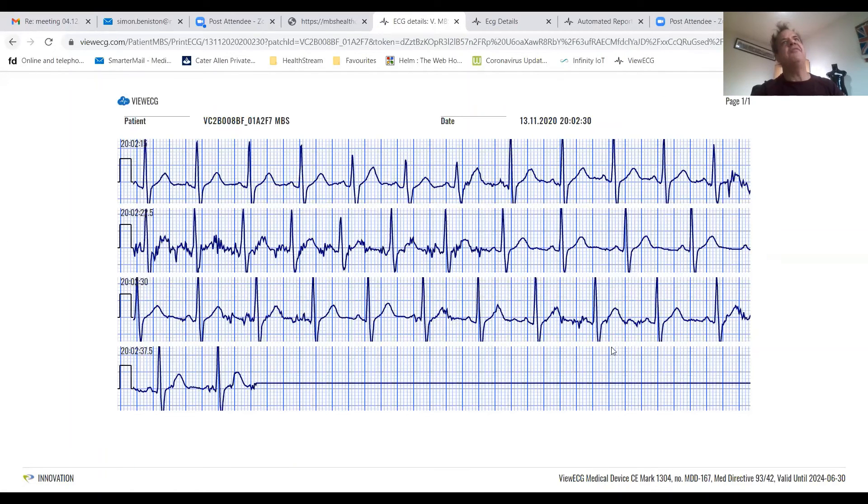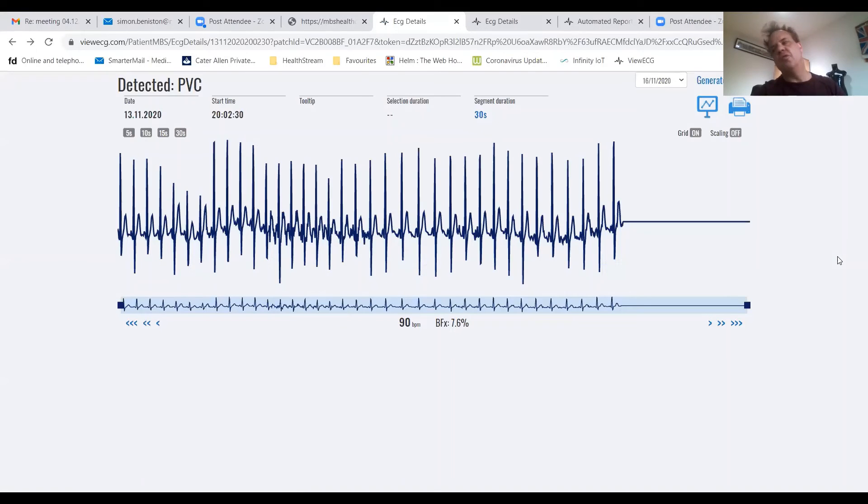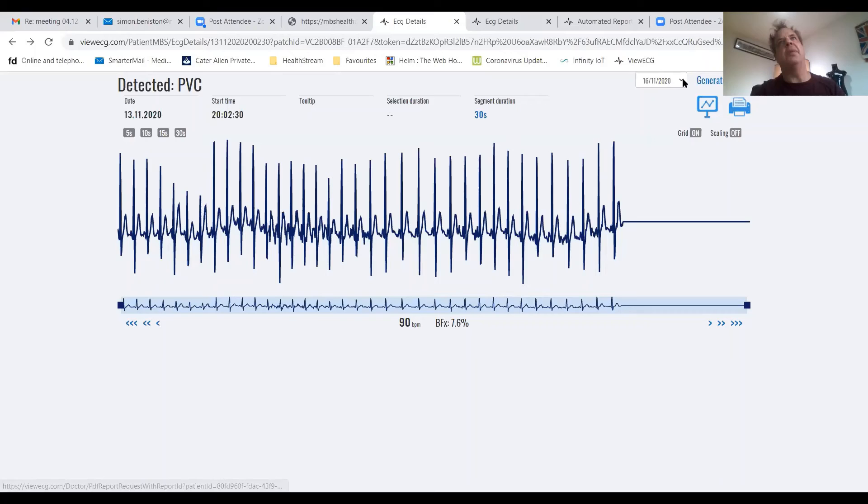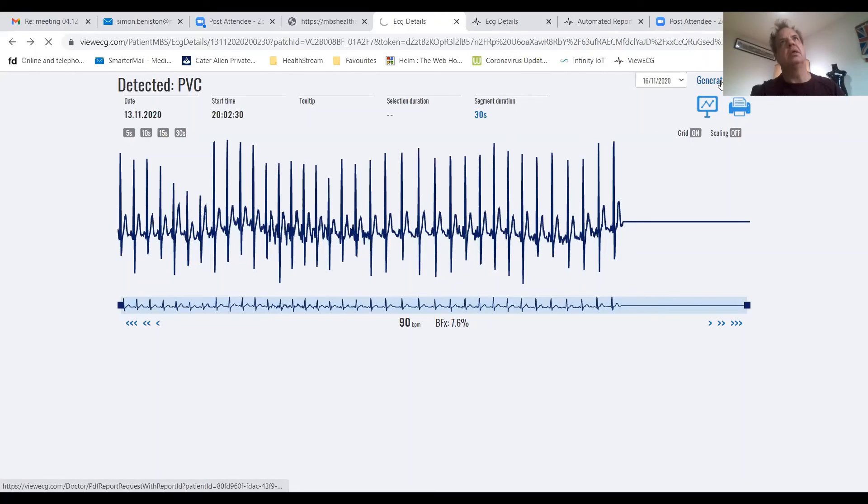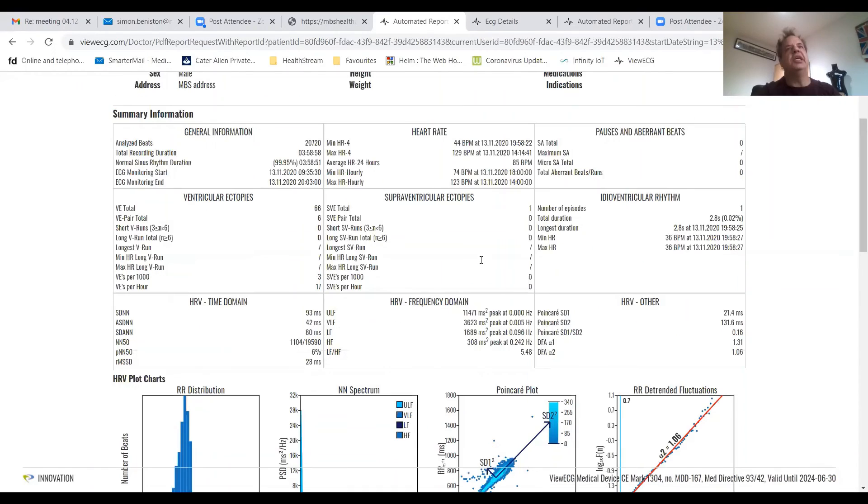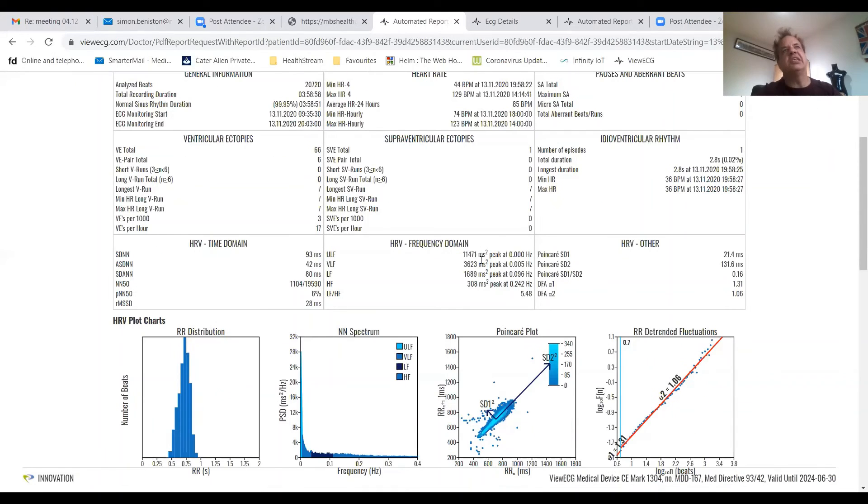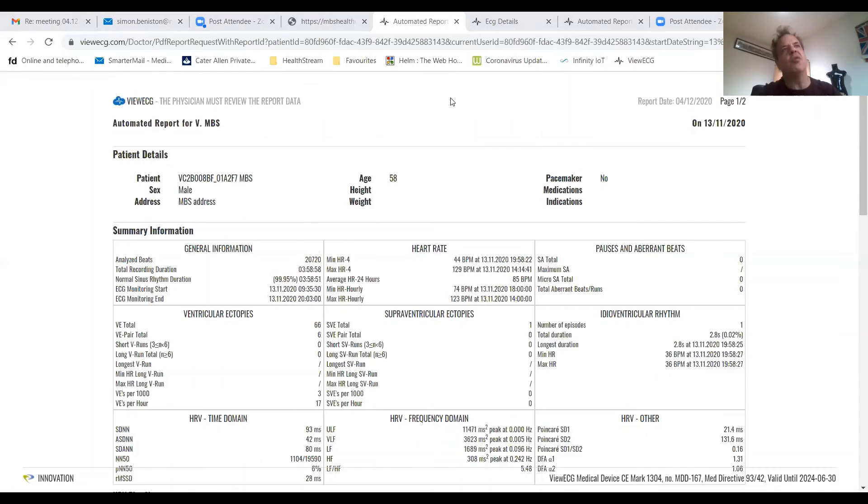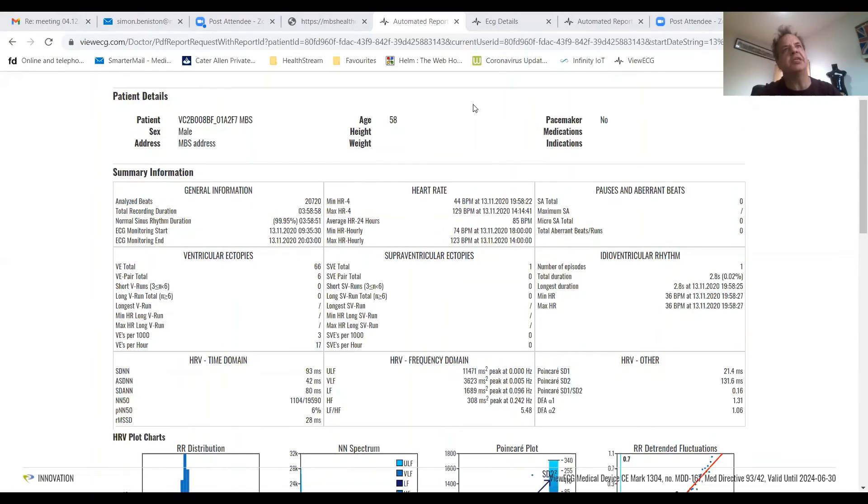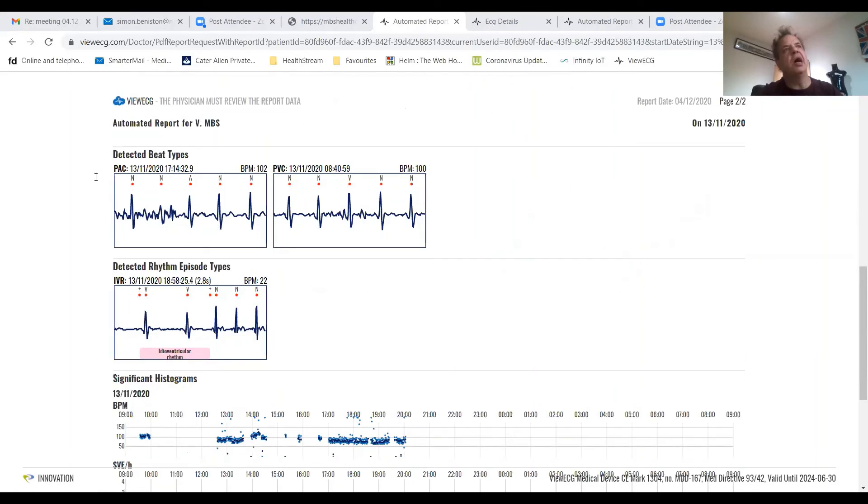And finally, we can provide full cardiac ECG reporting on demand by date. So if I select this, here you will see this. This is a full ECG cardiac report for this patient showing heart rate, HRV, starting to show arrhythmia detected.